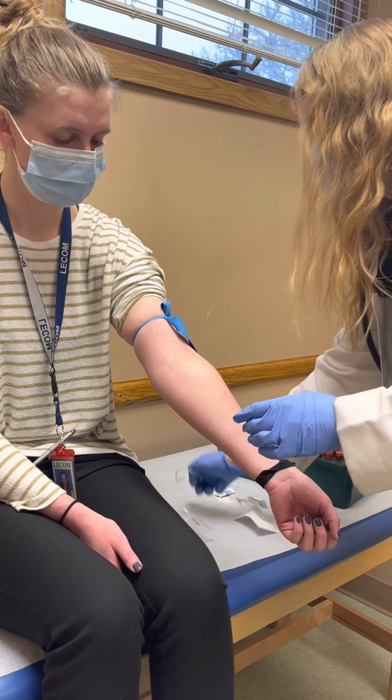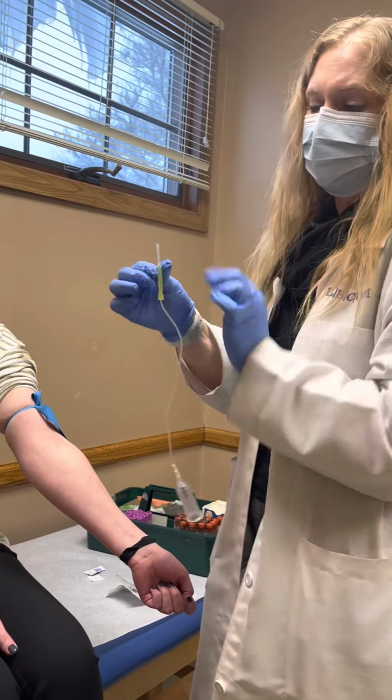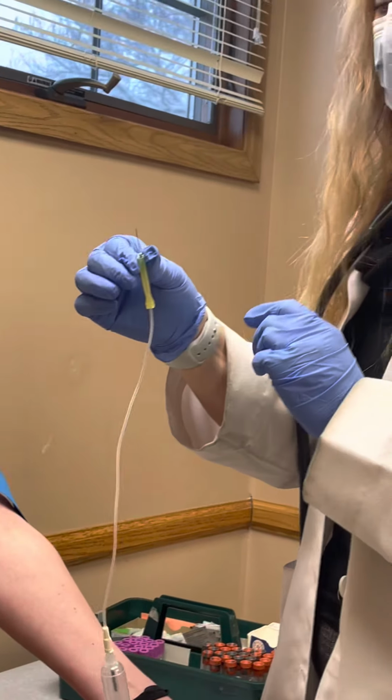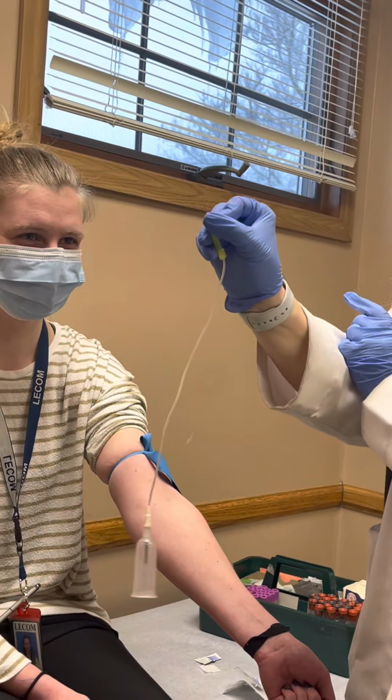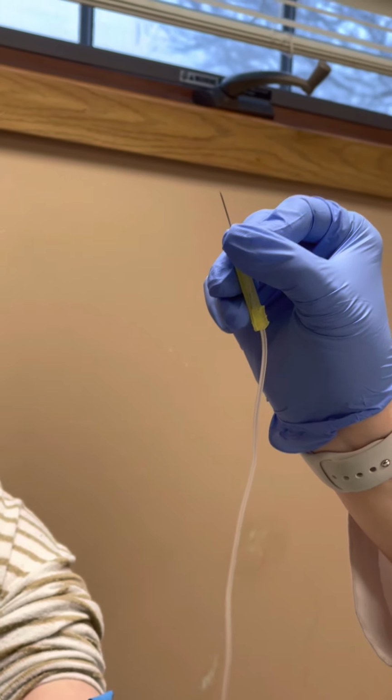Okay, so now this is what you will be doing with your dummy arm. When you grip the grippers, you're going to pull this straight off. Don't poke yourself with the needle. If you see there's a little bevel, and the bevel goes up to augment flow. Can you see that? Kind of, sort of? Mm-hmm.